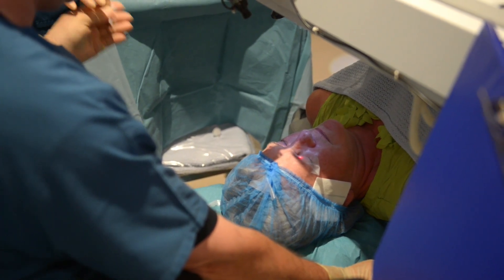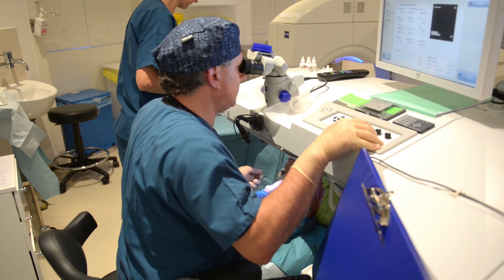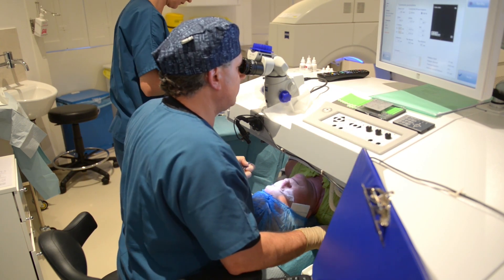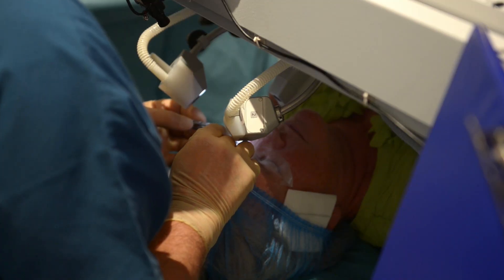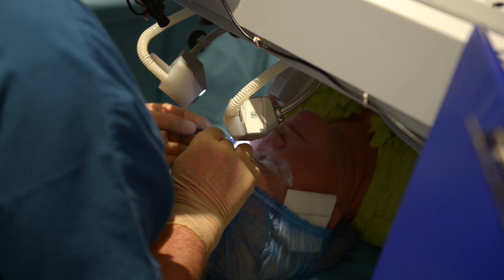For the last 25 years or so, an ultraviolet laser has been the mainstay — a laser which, through billionths of a second pulses, removes millionths of a meter of tissue from the cornea. These very fine sculpting procedures change the curvature of the cornea and the focusing power of the eye.